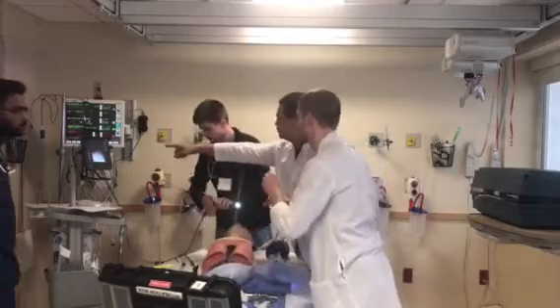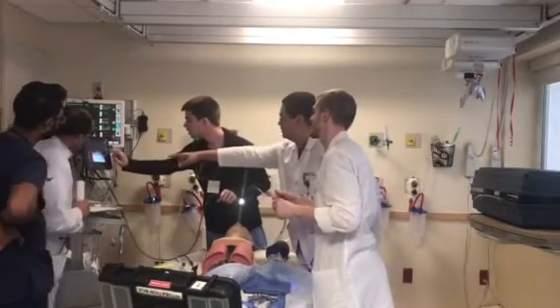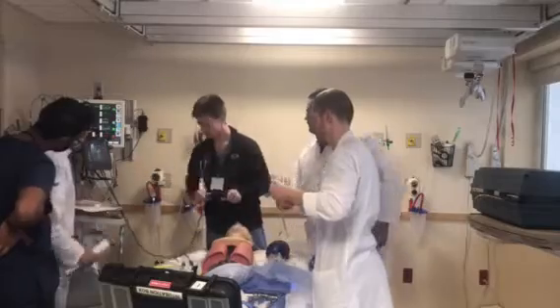We have to change it one second. Press B, it's A actually, press A. Yeah. All right.